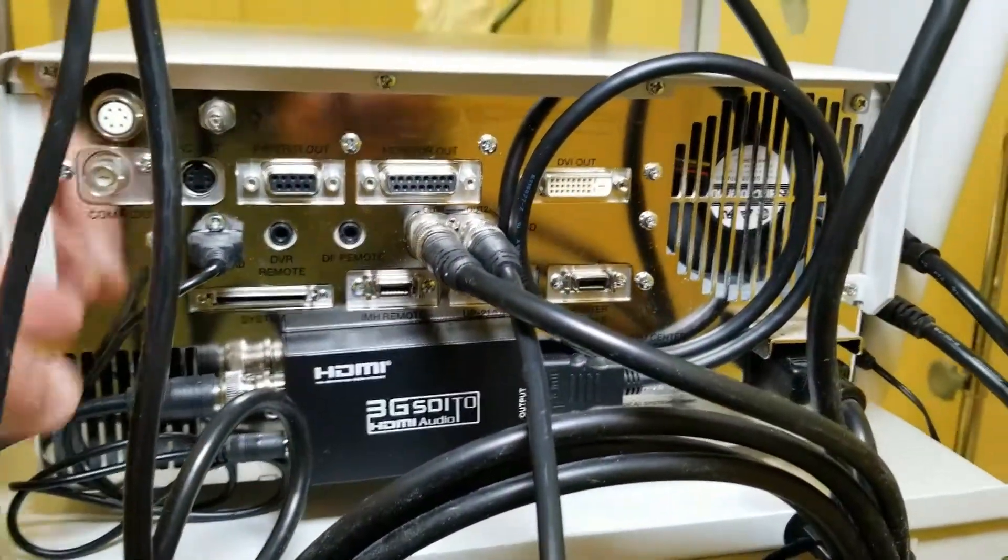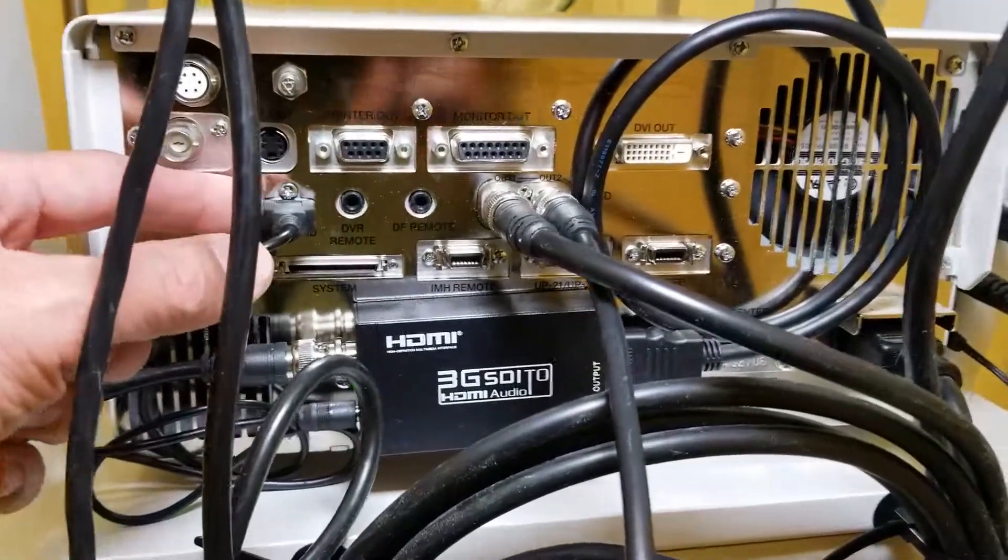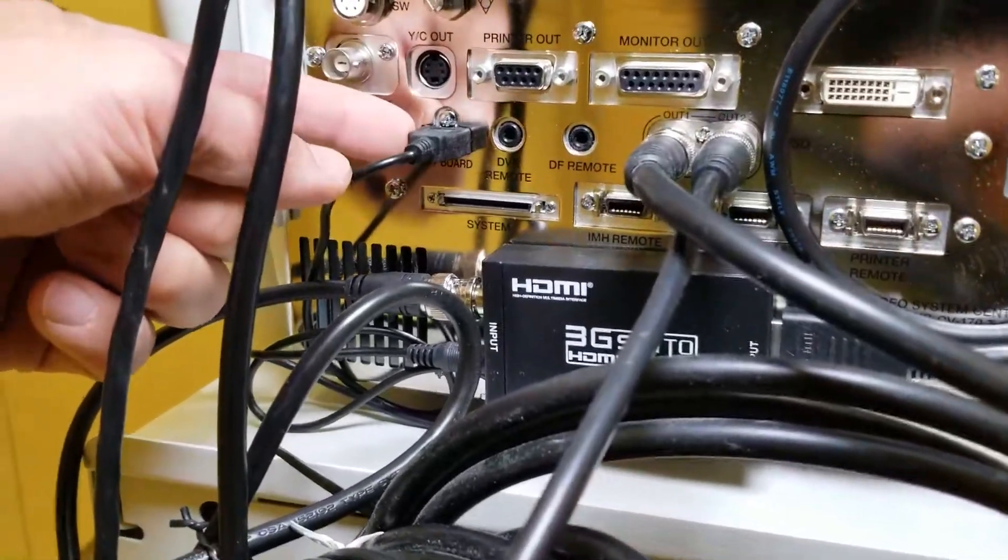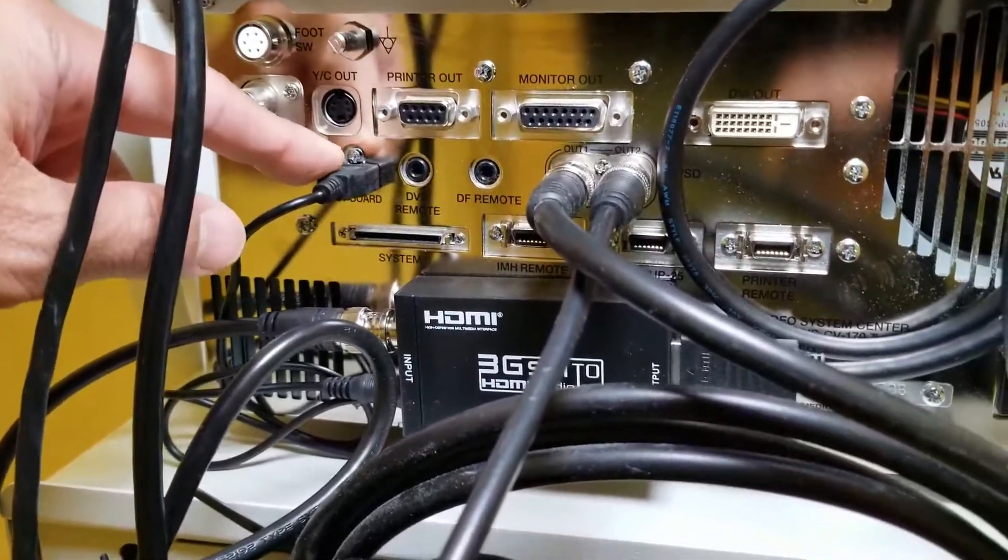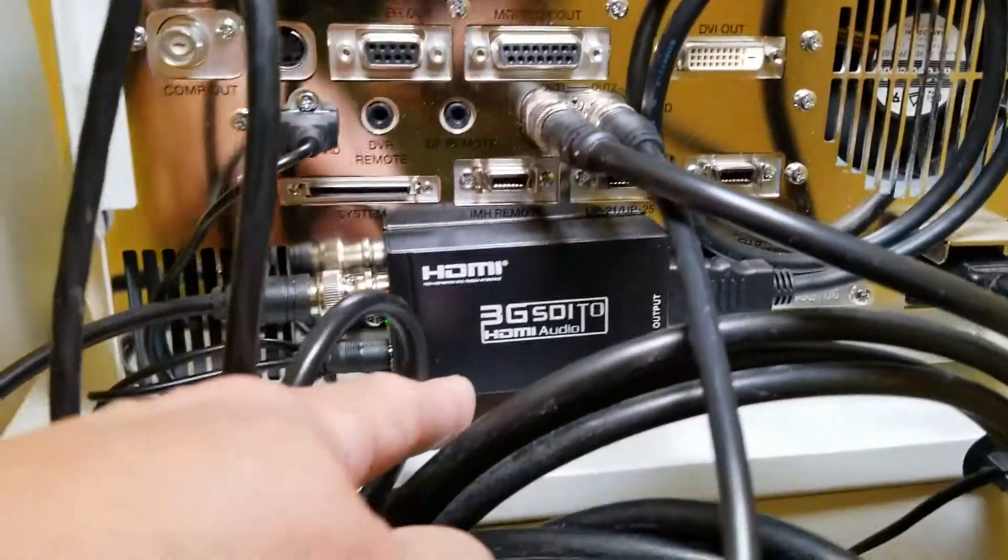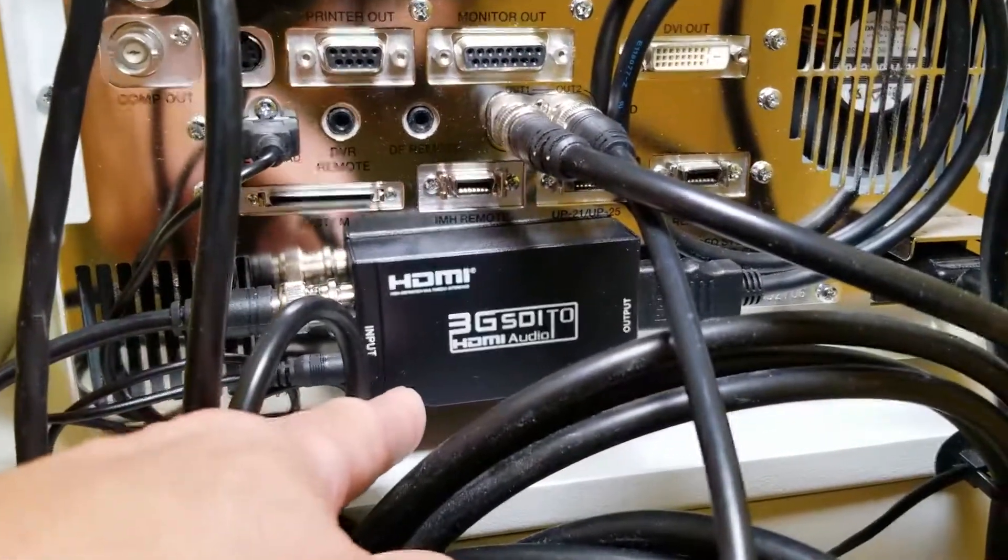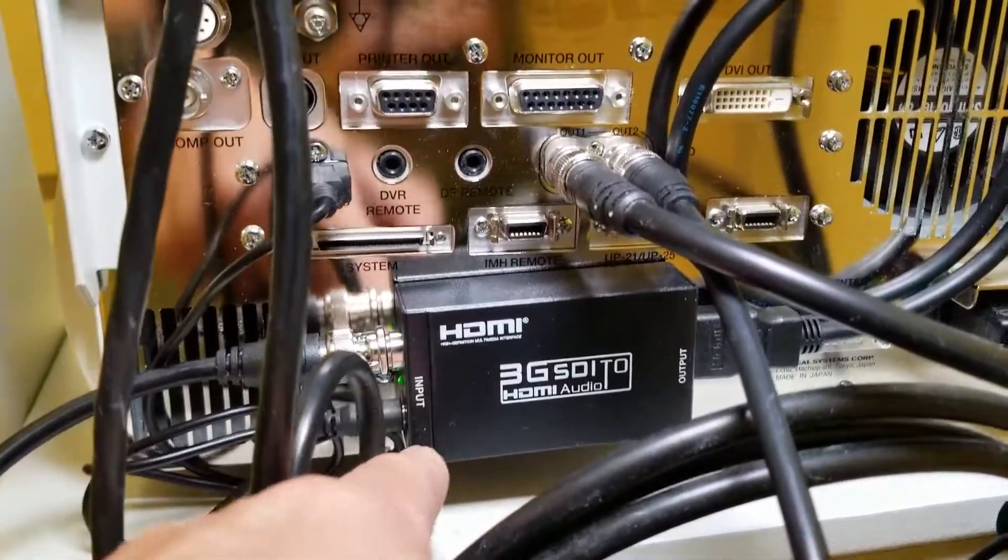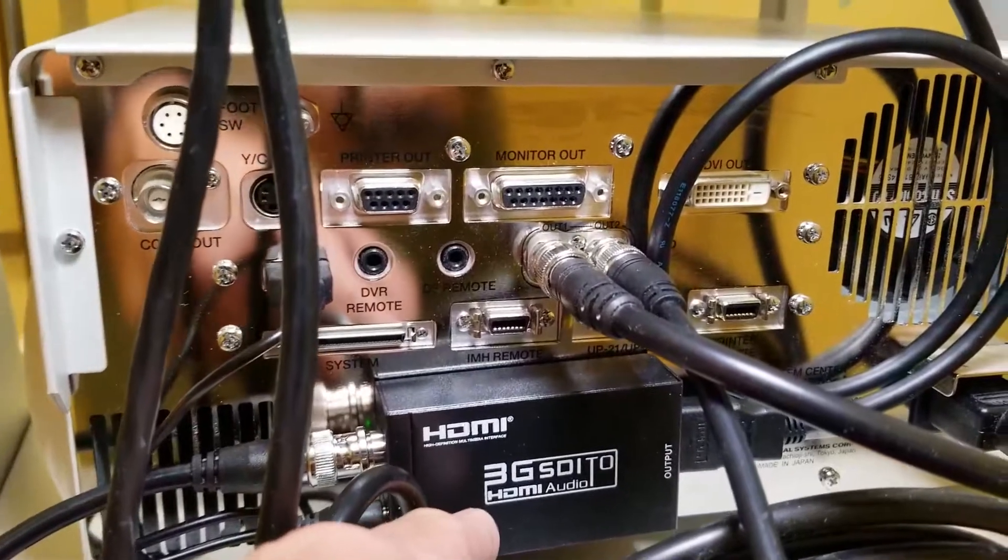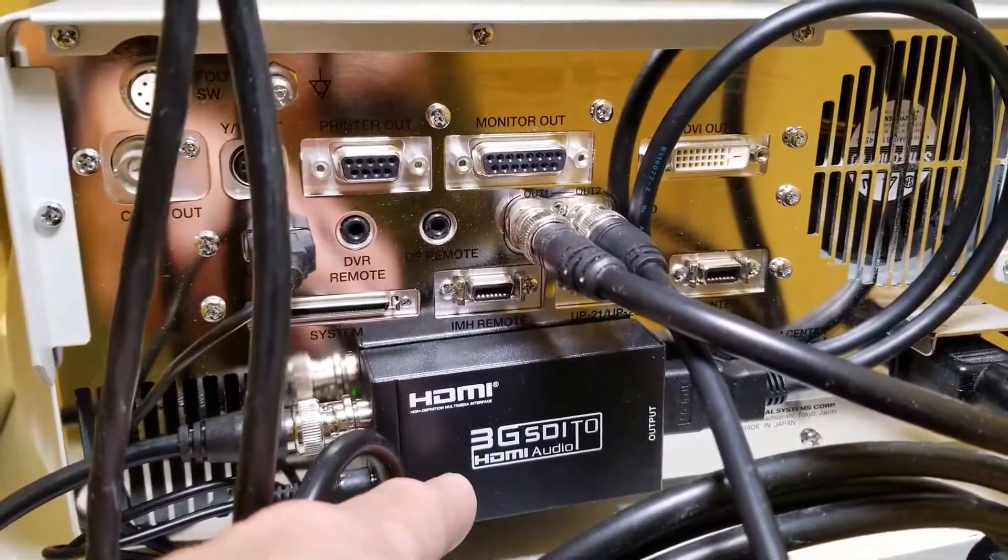Powered, believe it or not, by USB. If you look at this jack over here, it says keyboard. It puts out just enough voltage to supply power to this little HDMI converter going from SDI to HDMI.